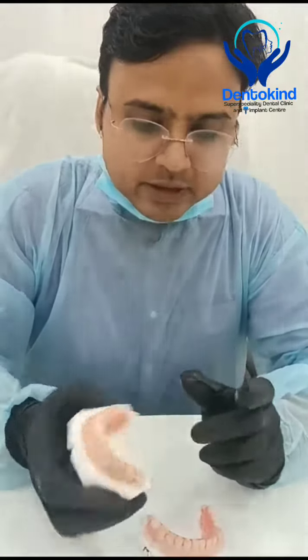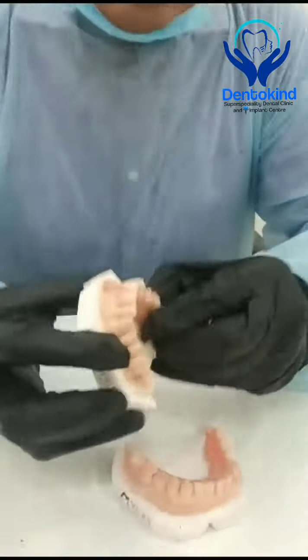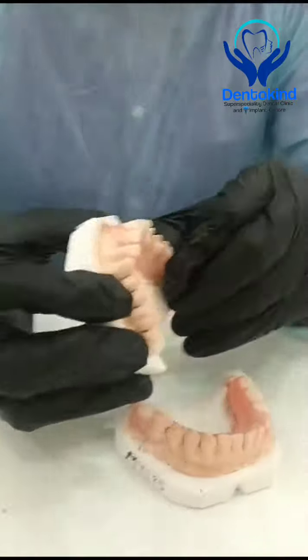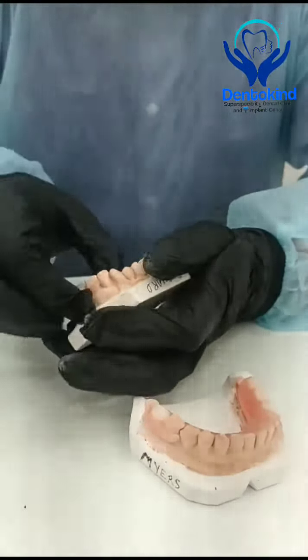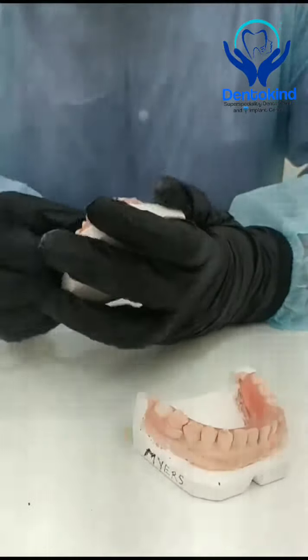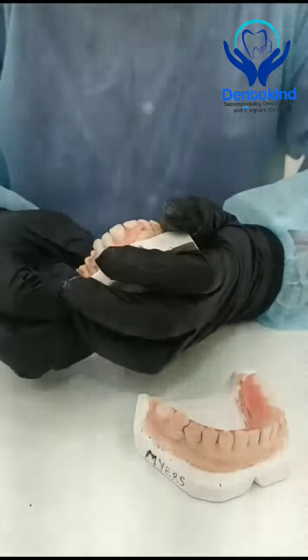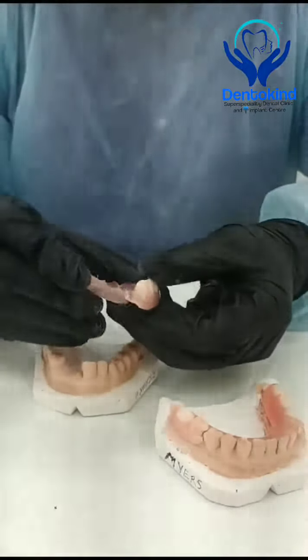In the upper arch, they were missing anterior three units and one posterior unit on the left side. We have fabricated this removable flexible partial appliance. Let me show you how it fits — pretty tight — and you can see the flexibility.